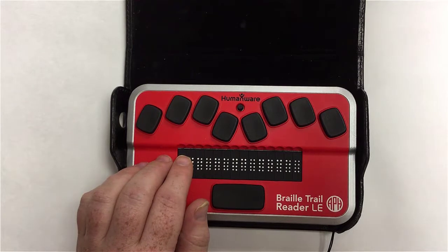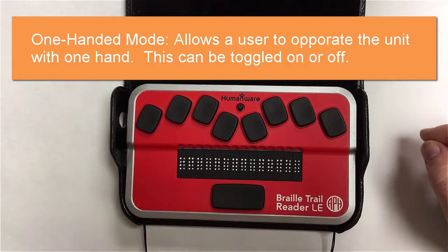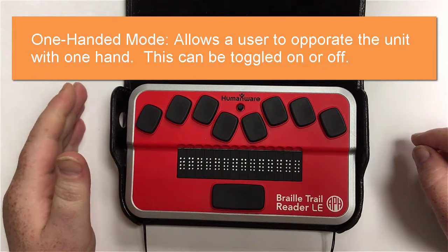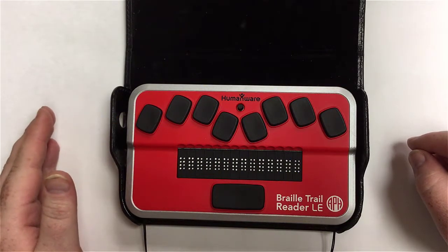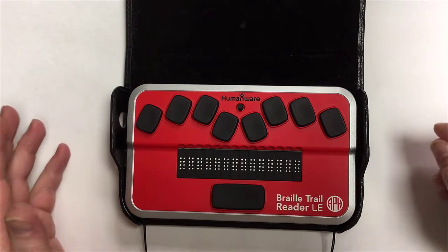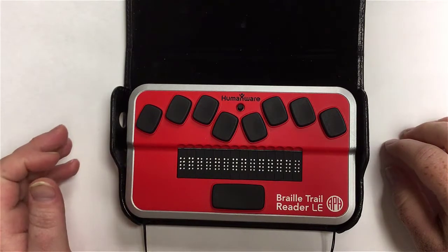The next option is one-handed mode, a toggle to turn it on or off. It allows a user to operate the unit with just one hand — useful if you're a one-handed Braille user, perhaps after a stroke, an accident, or a hand injury. This is where you would turn that on and off.